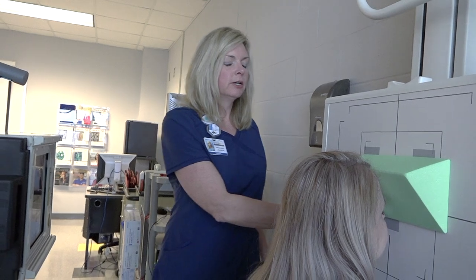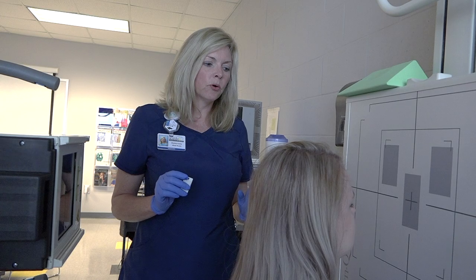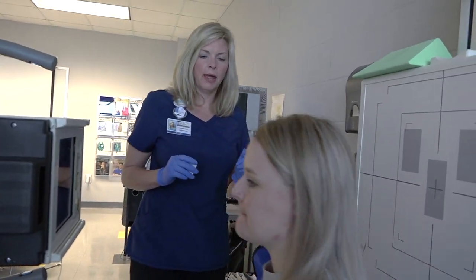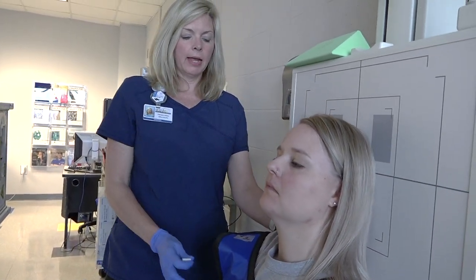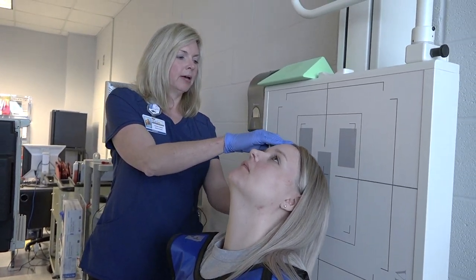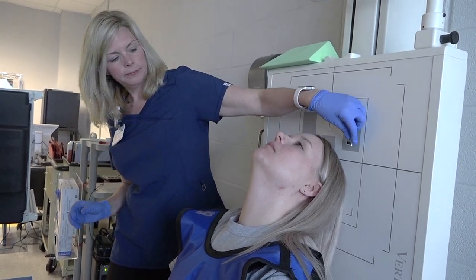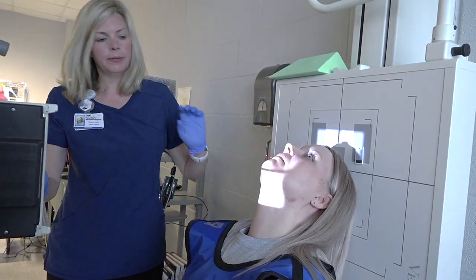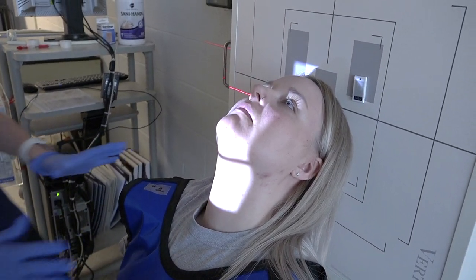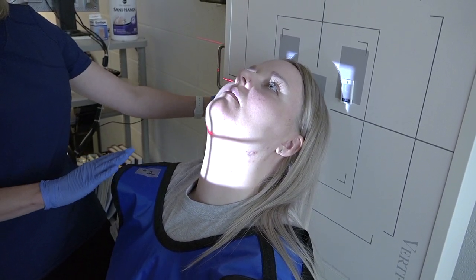Our last projection with the sinuses is the SMV. And again, it's the same SMV for the skull. So if you'll turn around, this is where you extend your neck back. If you can kind of move the stool forward just a tad and extend your head back as much as possible. So you put the vertex of your head against the board. Centering is the same again, so we're going to move 1.5 inches below the mandibular symphysis. I'm going to move you over just a tad. We'll line up your tube and bucky.